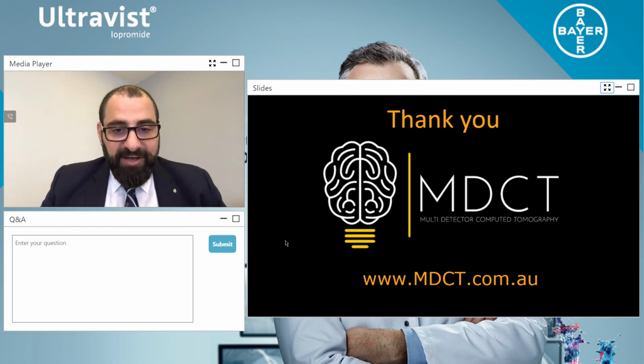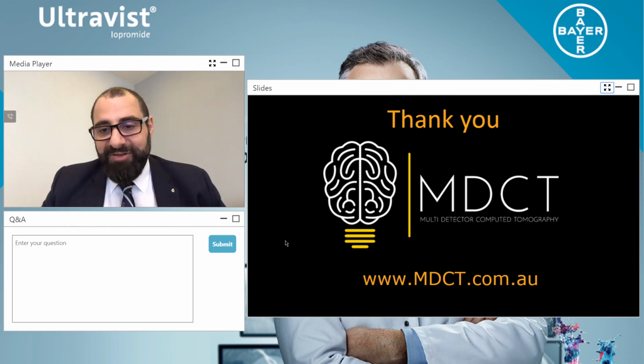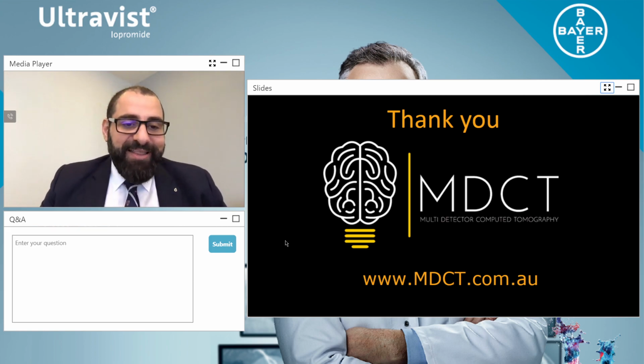Claire Chow: Hi Charbel, for the late arterial phase, can I use a timer set at 35 seconds instead of bolus tracking? That is an amazing question. Let me tell you something. Every human body is different. Every heart rate is different. Every cardiac volume, or the amount of blood leaving the heart, is different.